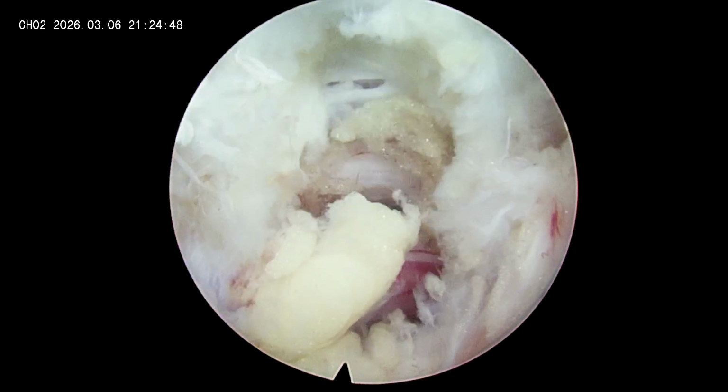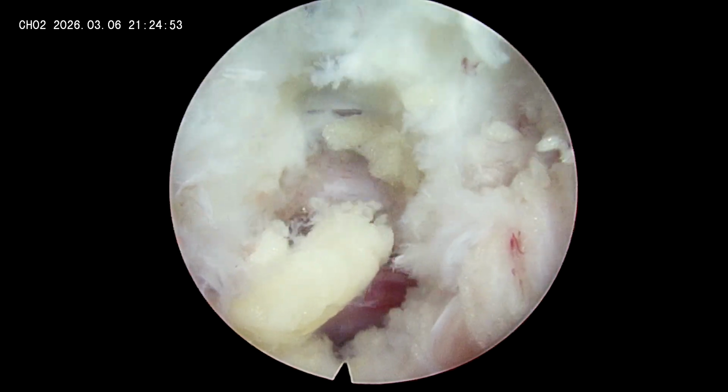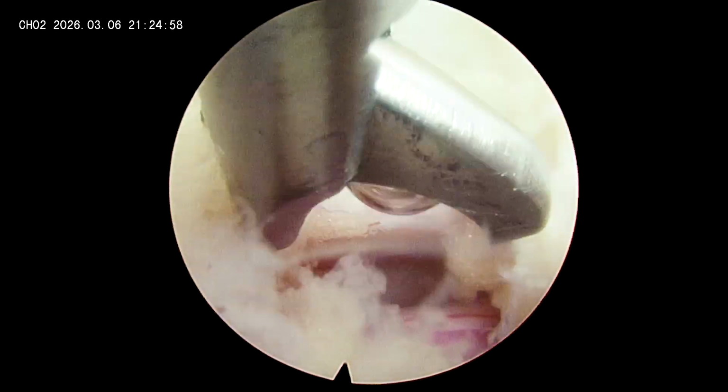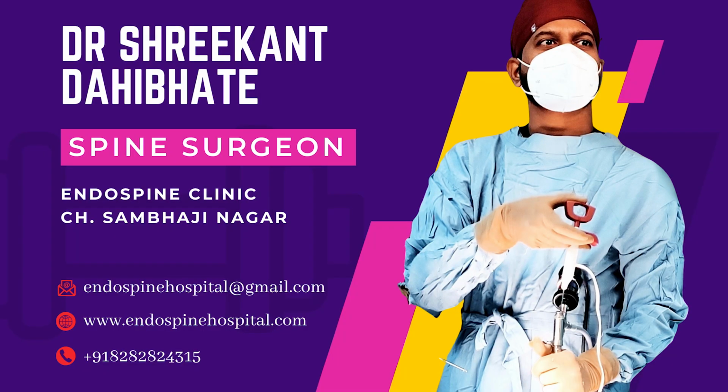One thing I just wanted to show you again here. See the size of the flavotomy incision here. I am now going to use the tip of the instrument. This is nothing but the cutter, and the tip of the cutter in open position will be not more than around 4 to 5 millimeters. So you can see our flavotomy incision was not greater than 5 millimeters. This was the end of surgery.